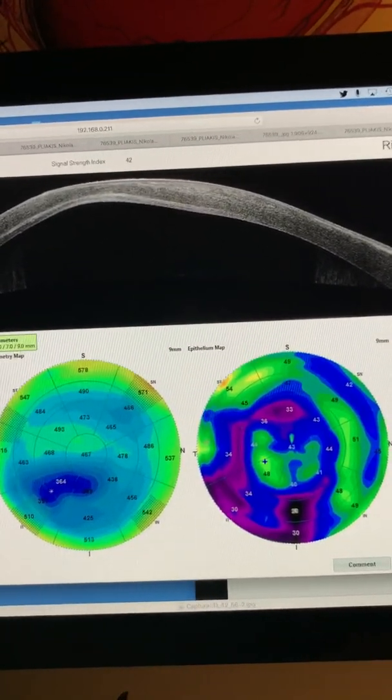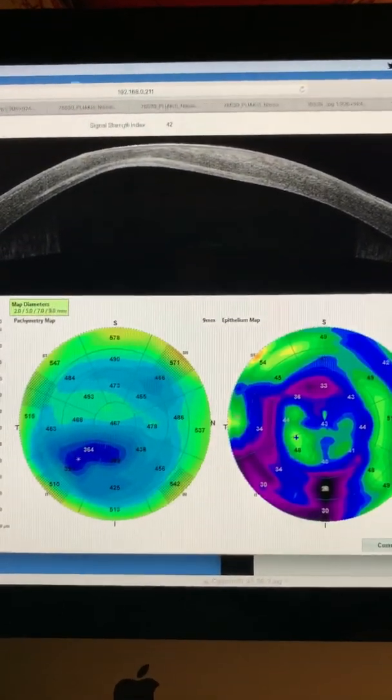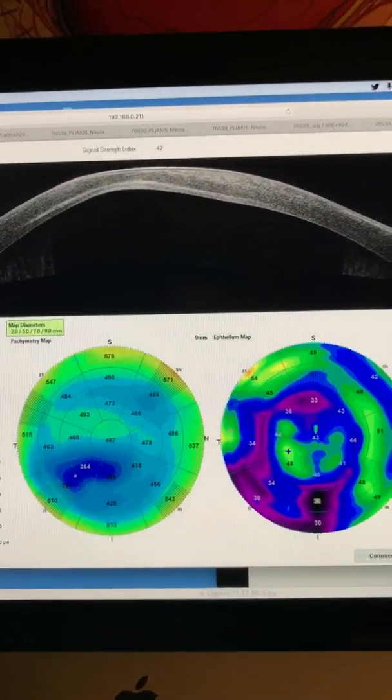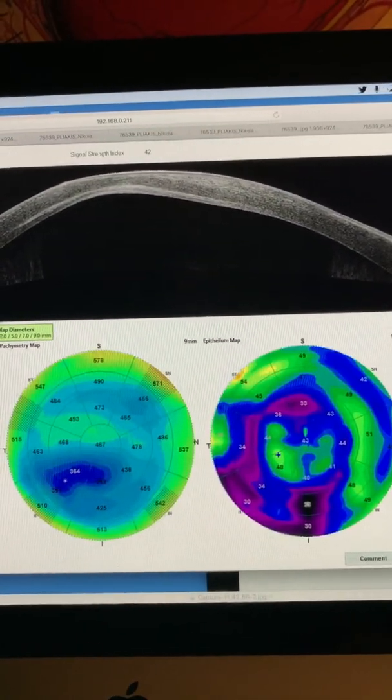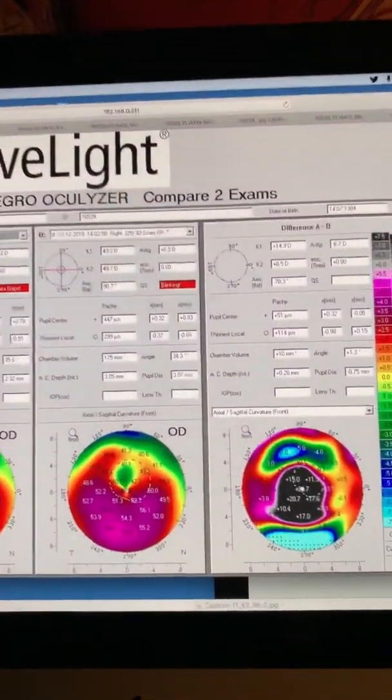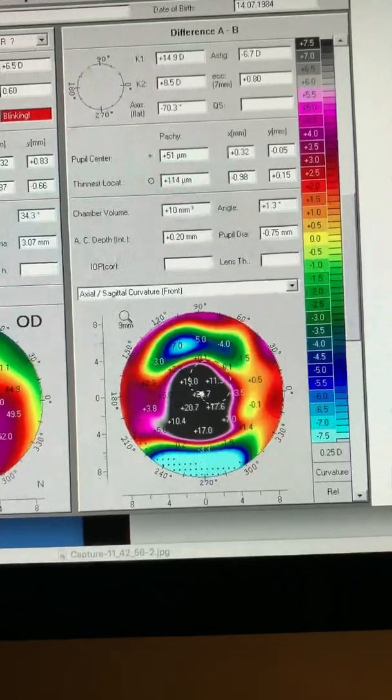This patient with a minus 2 contact lens is functioning in the 20/40 level. And again, a testament, let's see the difference maps on Pentacam, a testament of how this procedure can give dramatic flattening.